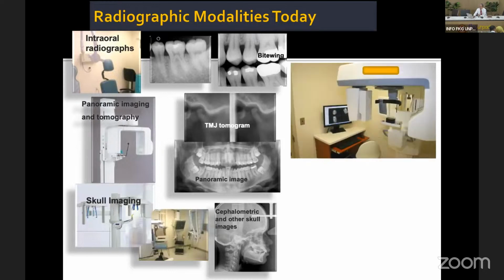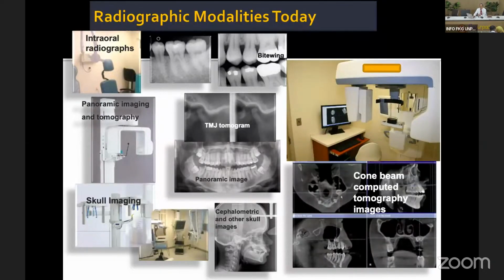But over the past 15 to 20 years, 3D cone beam CT has been widely used in dental practice. I was told that now in Indonesia, many schools and even practitioners also use cone beam CT in treatment planning. So this is a great progress in dental maxillofacial imaging.